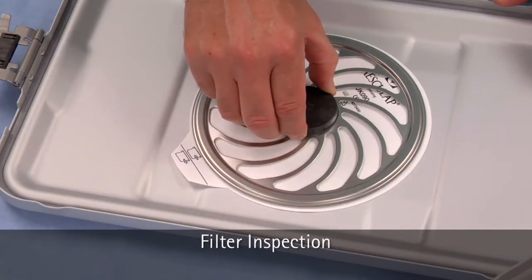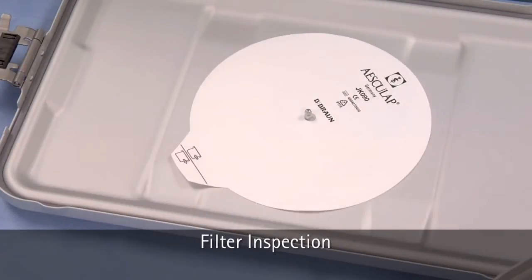Remove the retention plate and inspect the reusable filter for integrity. Please note that the filter does not need to be removed to be inspected. If the filter is damaged, you should consider the set not sterile.